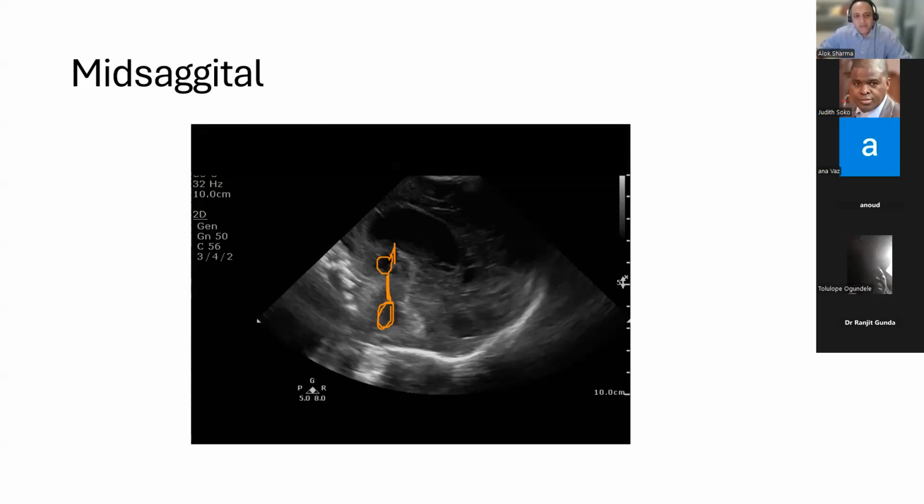You're just a little bit further forwards. You want to try and get your corpus callosum into the center here, but obviously it can be challenging if a baby's moving. Your corpus callosum is very thinned out. What was the gestation at birth? 32 weeks. And now corrected gestation?